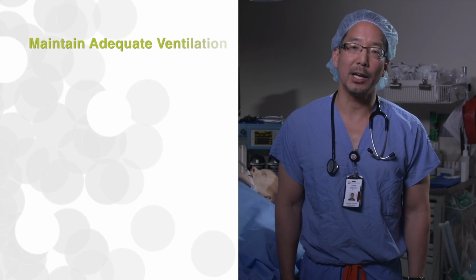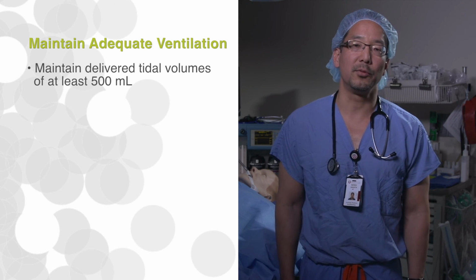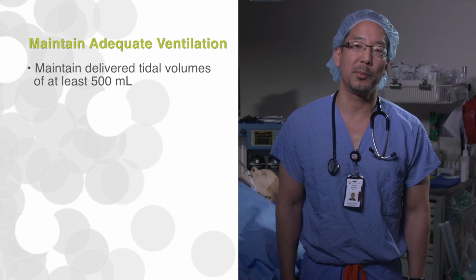Emphasis on maintaining adequate delivered tidal volumes of at least 500 milliliters is vital in the safety and efficacy of ANEclear, especially in spontaneously breathing patients. This tidal volume level will provide adequate oxygenation during rebreathing.